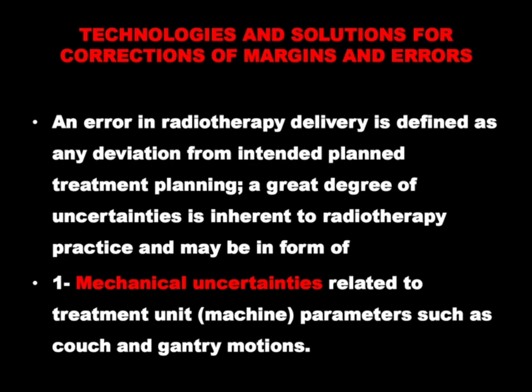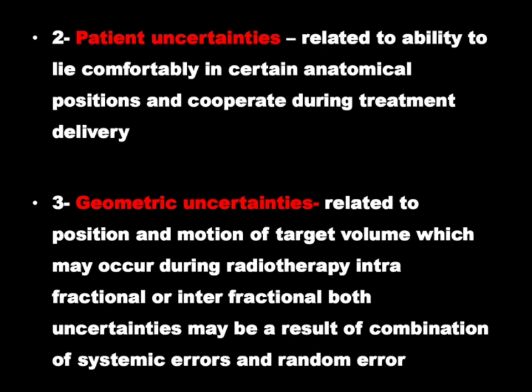For applicator identification and its reconstruction to plan optimized 3D planning, the isodose distribution is reviewed and optimized on the visualization of the dose distribution to the tumor as well as critical structures.